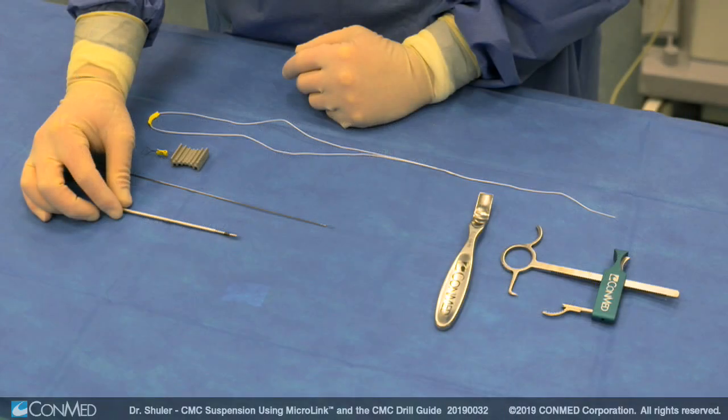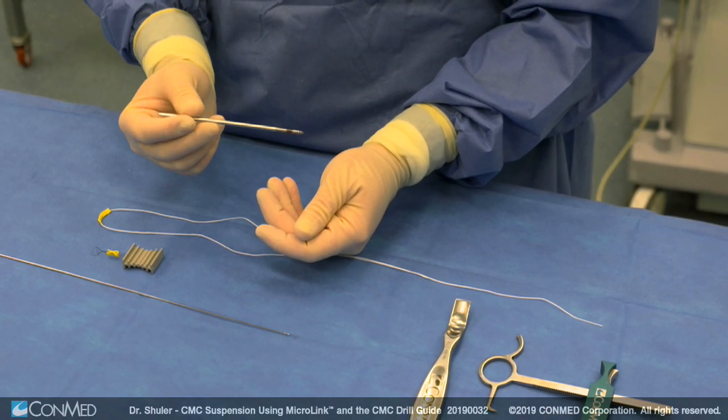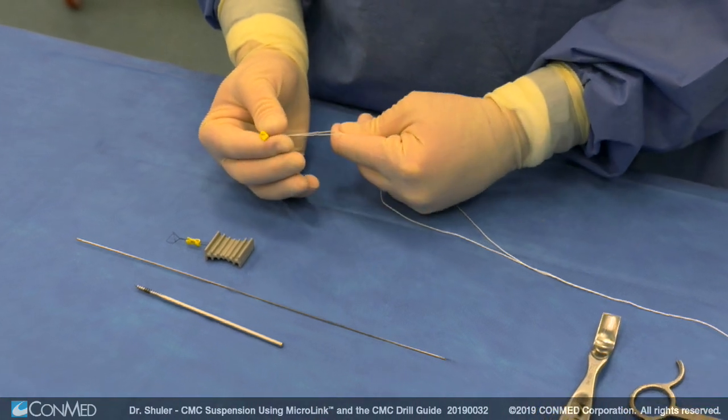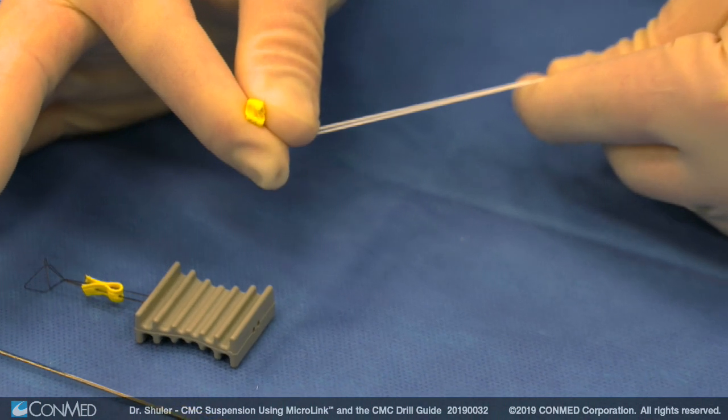The micro link system contains seven instruments. The first is the trapezial pin, which allows joystick control into the trapezium for complete excision. The second is the suture passing drill bit, which has a coined-in nitinol loop. The third is the radio-opaque micro link all-suture button, with two number two suture arms that are spliced at one end to allow for passage.